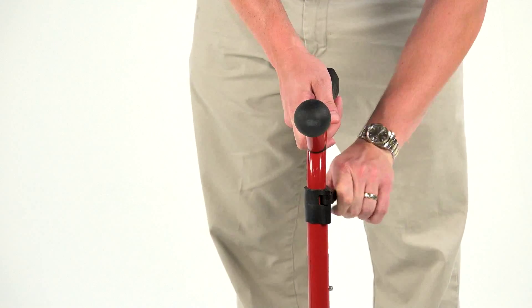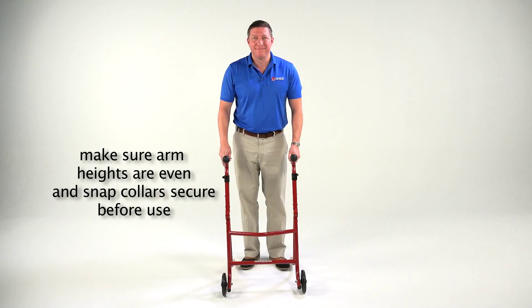Repeat with the other arm. Make sure the arm heights are even and the snap collar is secure before use.